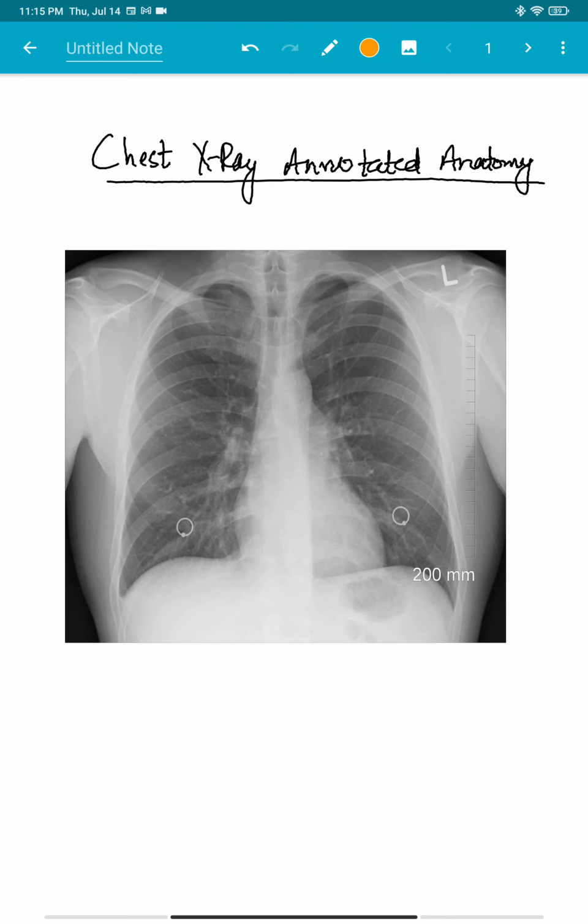So today we have decided to start our X-ray chest series. This is the first lecture of many lectures coming soon, inshallah, about X-ray chest. The first lecture is about the ABCs, or the initial things of the evaluation of X-ray chest.